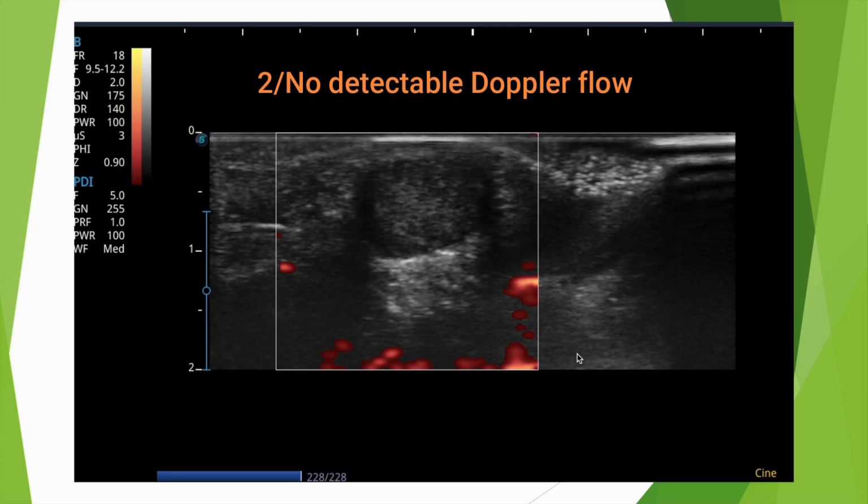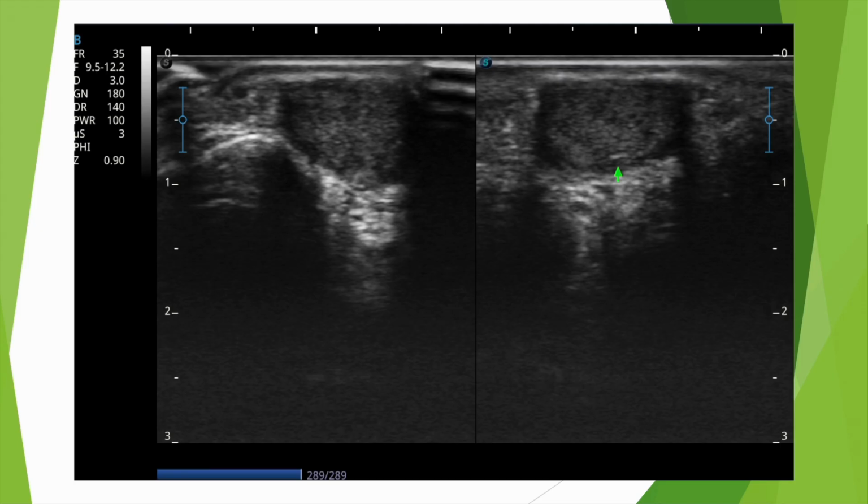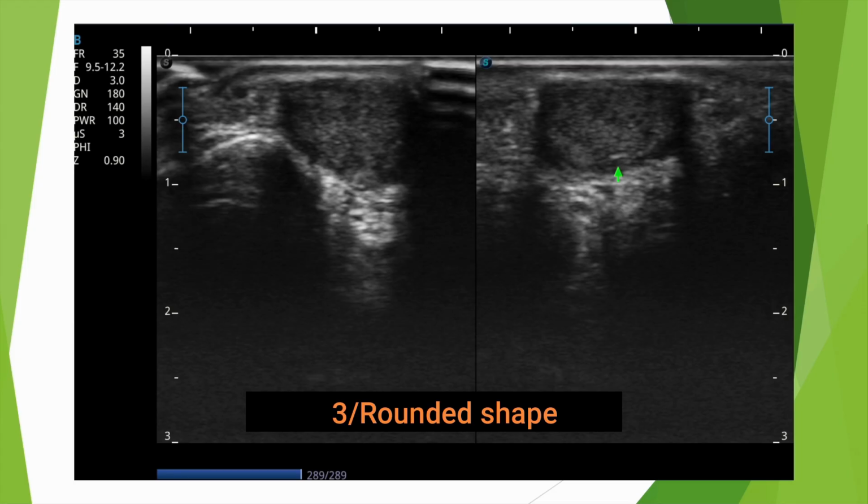There's still one last important criterion you absolutely have to keep in mind. And I really emphasize this a lot in my trainings. The double grid technique. You need to make sure, in both directions, that it's not something tubular. And we'll look at that in just a moment, in an upcoming video, next time on YouTube. Specifically, I thought of a case of galactophoritis that I'll post for you, where we could have had an image like this in one direction, but in the other direction, in the other axis, we have something tubular. So always use the double grid technique, a transverse view and a sagittal view.